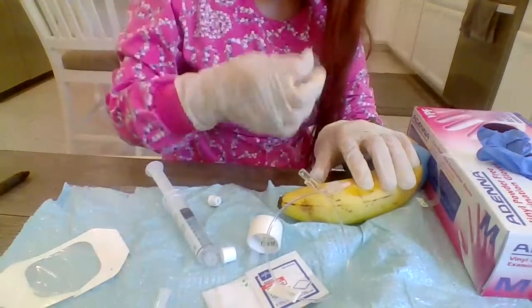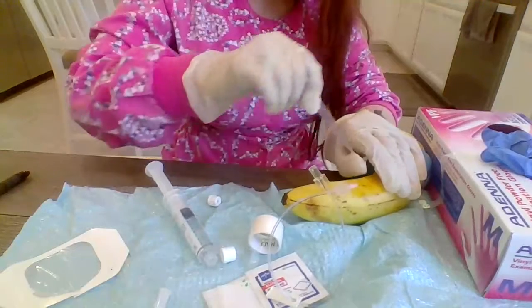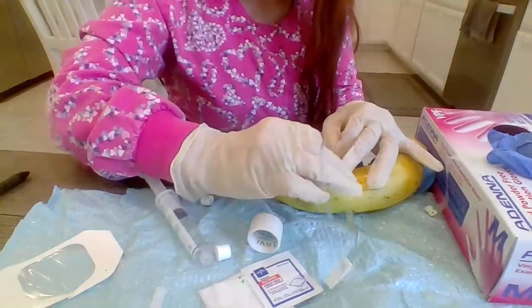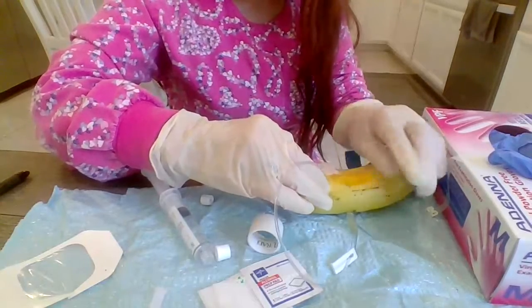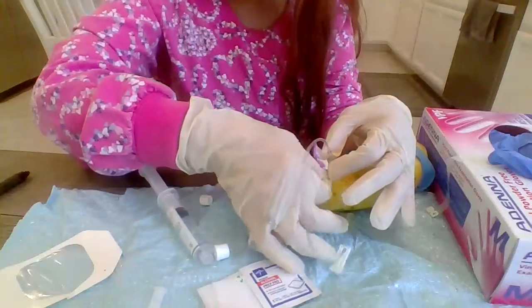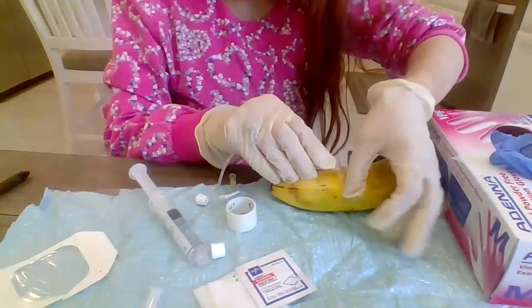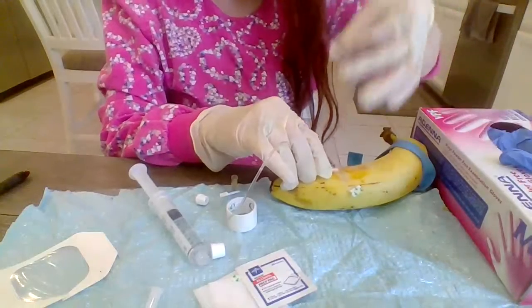Now I'm going to go ahead and tape it under and around, and then tape it across.